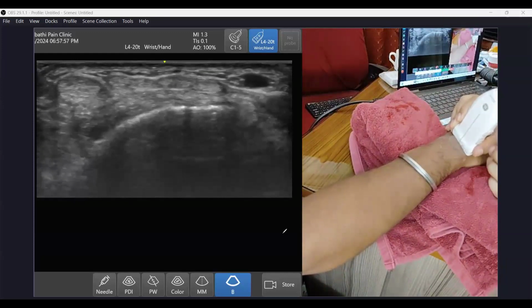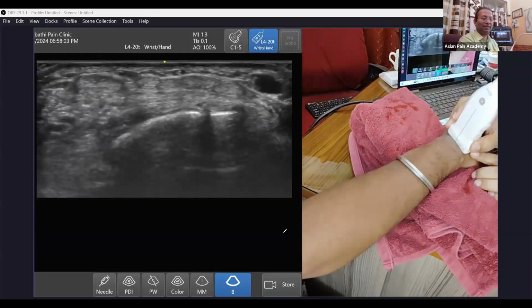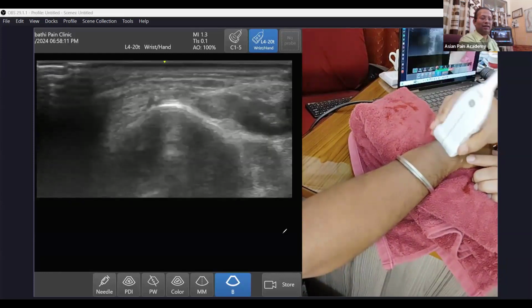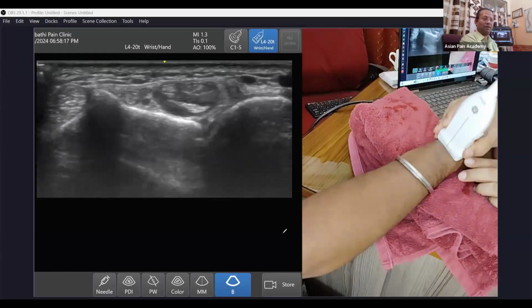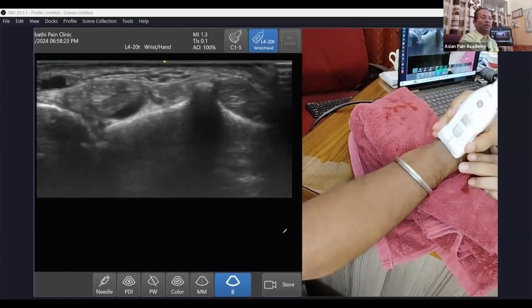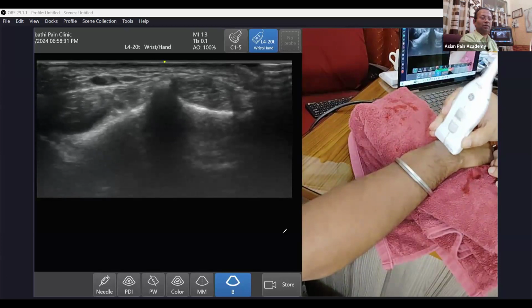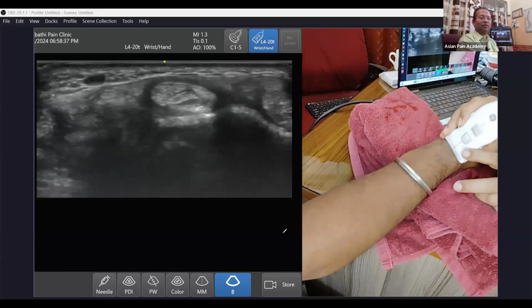Doctor, there is no sound. Sorry. Okay, I did not show you the extensor retinaculum. So the extensor retinaculum is seen in that area where compartment 4 is seen clearly. Okay, so here again let us see Lister's tubercle. I'm holding it the opposite way. So Lister's tubercle. On the right side is your compartment 2, Lister's tubercle under the yellow mark, 3, and this is 4. So we will see all the sleeves here.